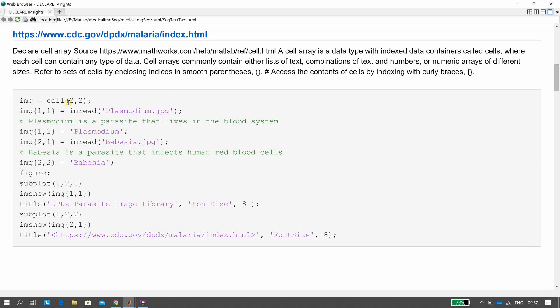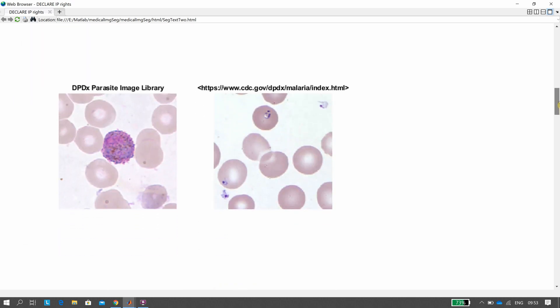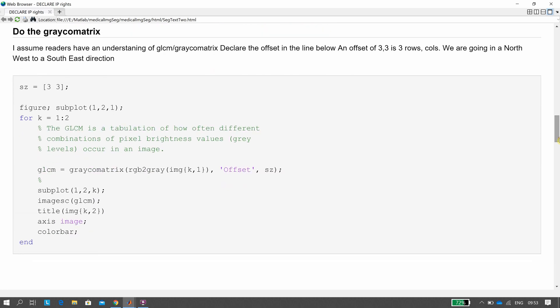Looking at here, we read in the plasmodium image and a babesia image into a cell. I assume you know what a cell is — if you don't, you can look it up. So we've read in the two images. We'll be looking at plasmodium in particular — we're trying to segment that out by texture. In a little for-loop there, we get the GLCM, the gray-level co-occurrence matrix for both of them.